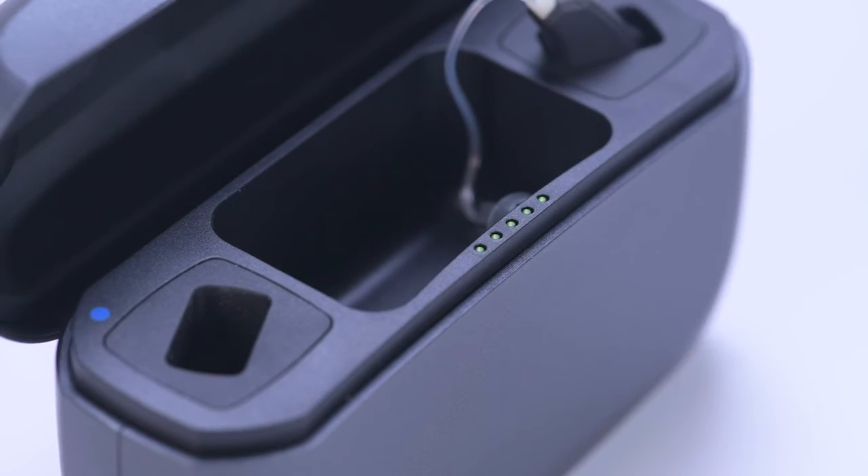When hearing aids are inserted or removed, the LED indicators show the current battery level for 10 seconds.